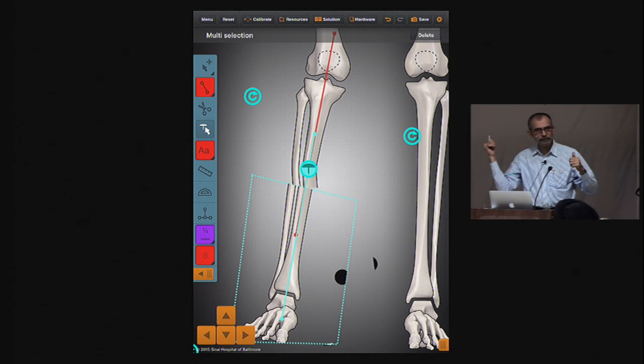So that's what on our C-arm pictures, you showed them that, Divya, that we did the translation first. So I'll show you that again. So there what we do is we build in the translation and then do the angulation, so that now the axis is corrected. But if you do it with an Ilizarov, it can happen automatically.